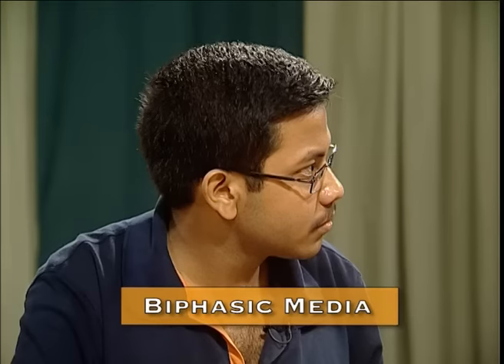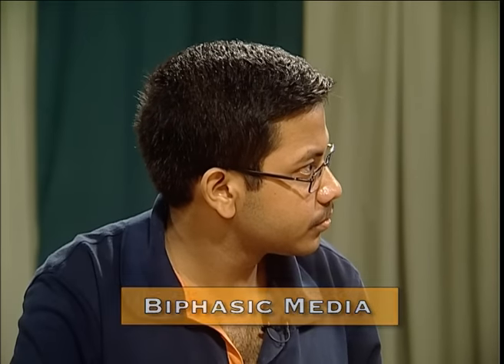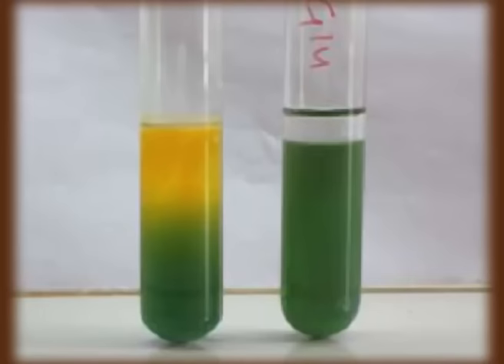The other two types of media which can be grouped under this category are semi-solid medium and biphasic medium. Semi-solid medium generally contains a low amount of agar. As the name suggests, the medium has a semi-solid consistency. It is formed by the addition of agar at 0.5 to 0.7%.